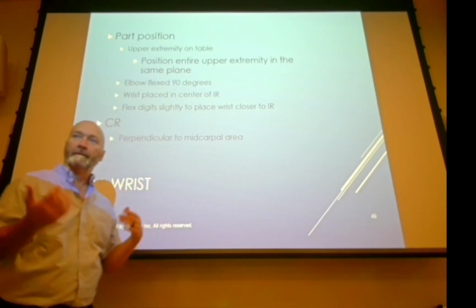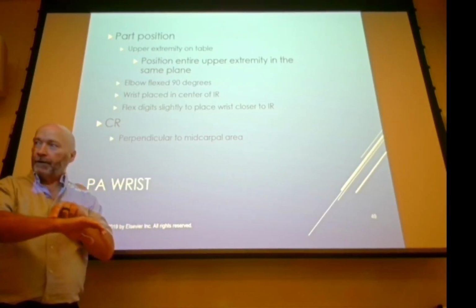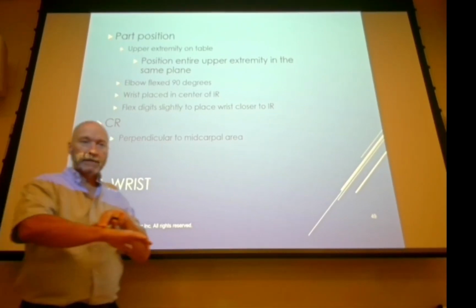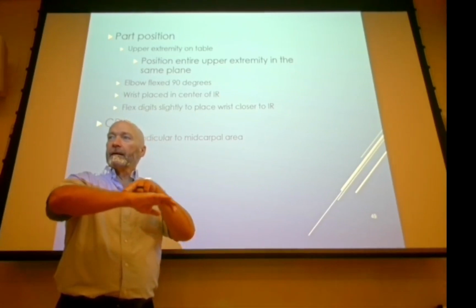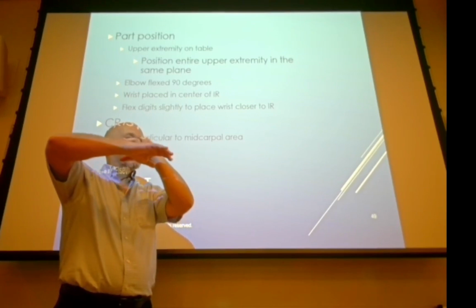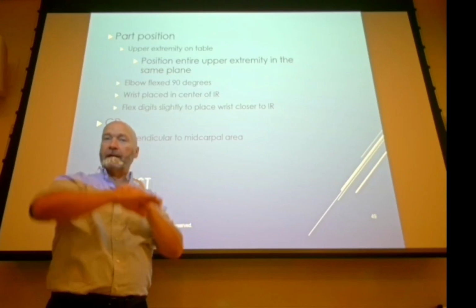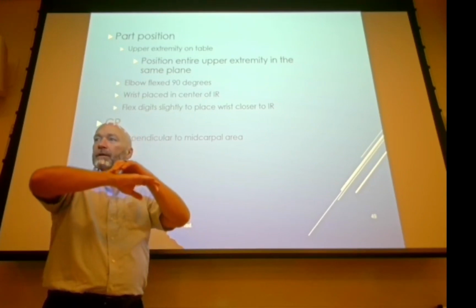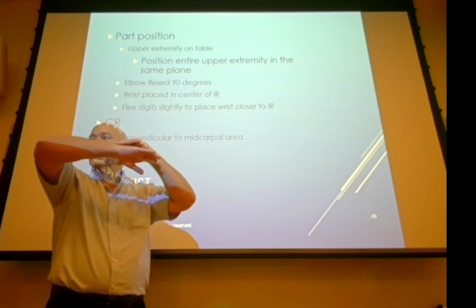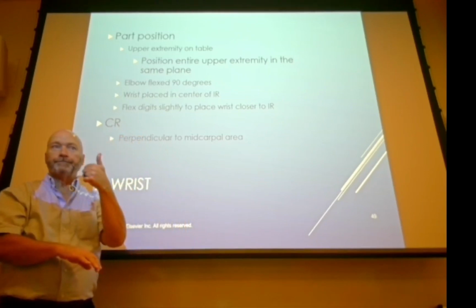If you keep your finger on your radial styloid process, or your ulnar styloid process, and you elevate that up to the shoulder level, tell me what happens. It goes away, right? So keep your arm bent at 90 degrees and mash on it and raise it up to the shoulder level. It's kind of freaky, isn't it? So if it's poking out the back, you're never going to see it in profile.